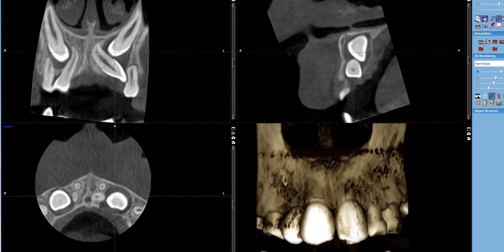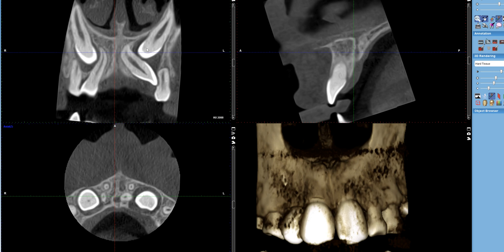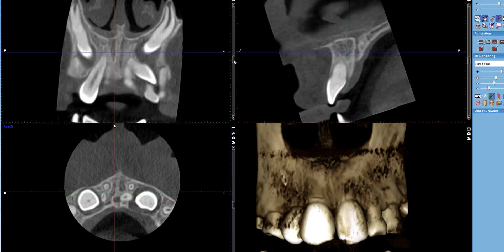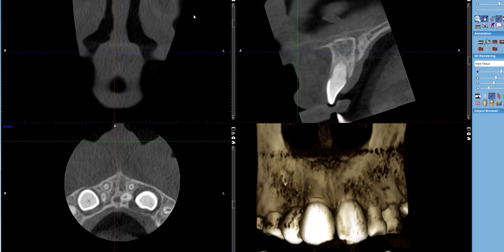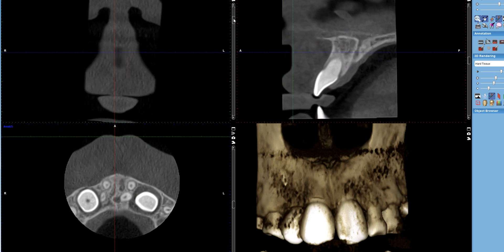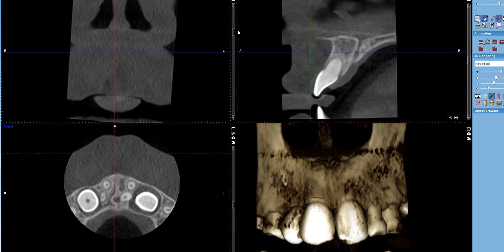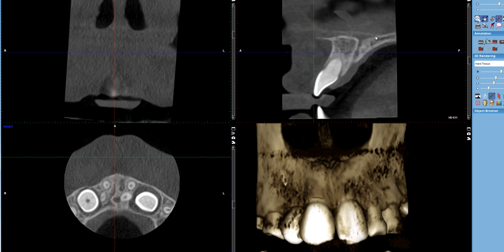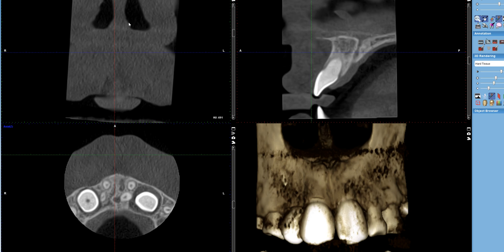You're looking at the CBCT scan of that patient. This image looks immediately very similar to the panoramic radiograph I've already shown you. Let me bring it closer to the center and look at the anterior portion of that scan. As I'm moving this, the green lines are also changing in other planes. This is the axial view and that's the sagittal view. If you're not sure which coronal slice you're looking at, this indicates the section of the volume.